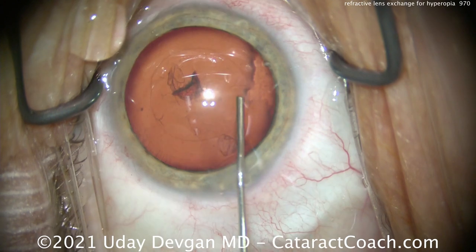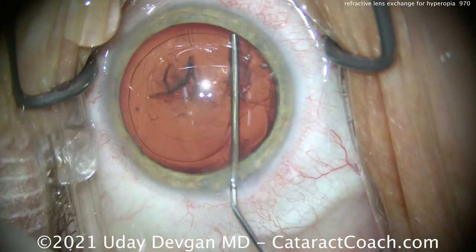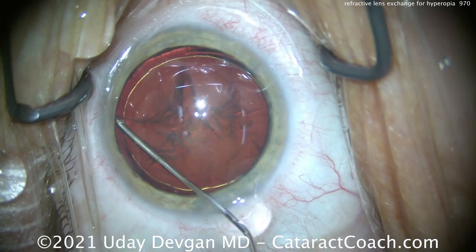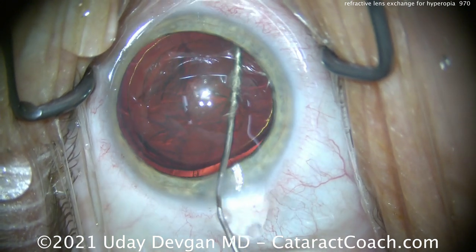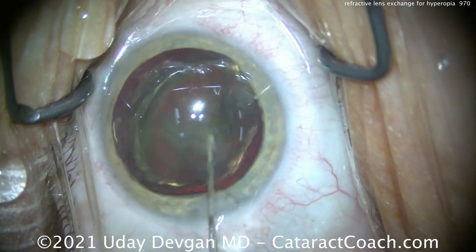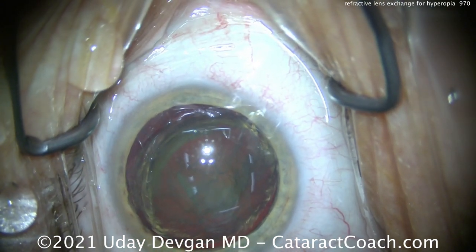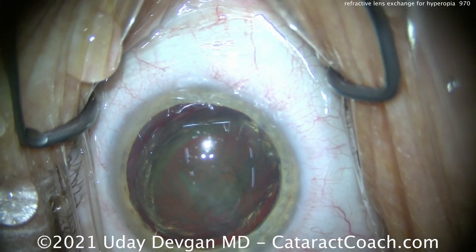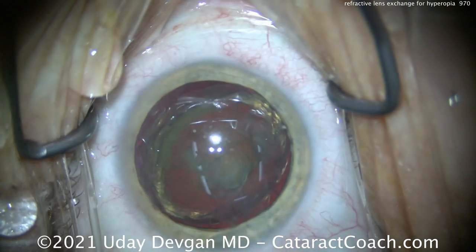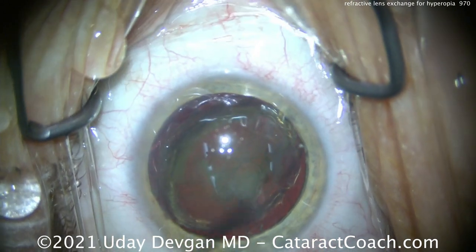The lens is relatively soft here. This patient is highly hyperopic and presbyopic as well, but there's really not any cataract, so we're doing an early lens exchange surgery in order to treat a refractive error — hence, refractive lens exchange. It's essentially just doing cataract surgery on someone prior to developing a visually significant cataract.